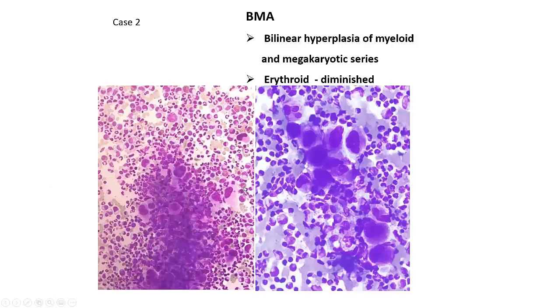Now this is on bone marrow aspirate, a typical picture from such a case where you find granulocytic hyperplasia. This is a bone marrow aspirate in 2 cases. And then you find megakaryocytic hyperplasia. And then you find that all the megakaryocytes in this are dwarf megakaryocytes. They're smaller with hypolobated nuclei. Again here, hypolobated nuclei, which is a typical feature, as I told you, of CML.